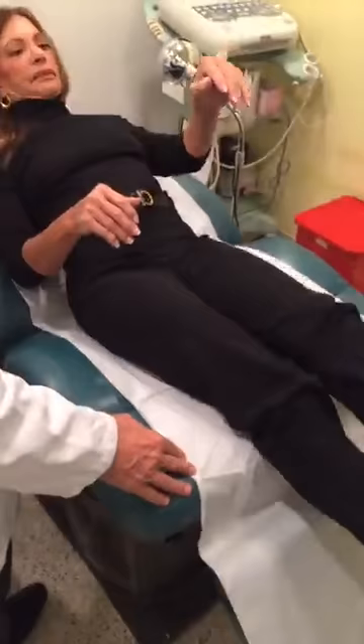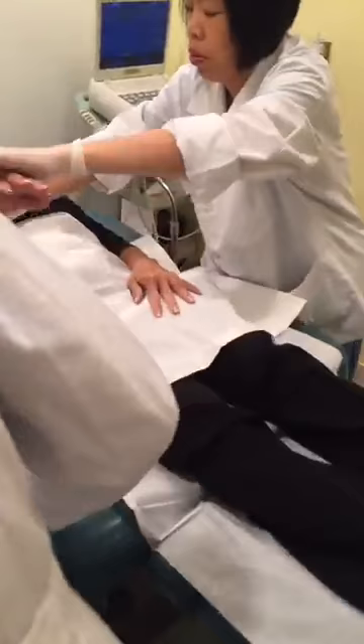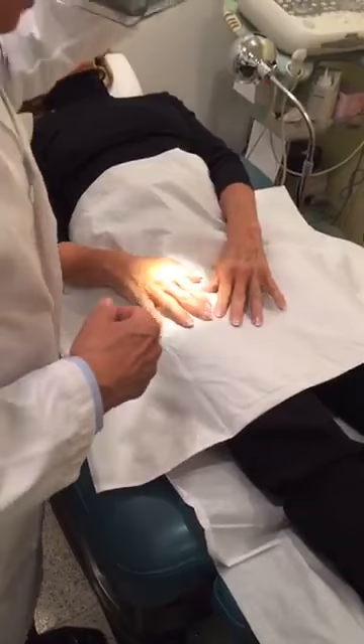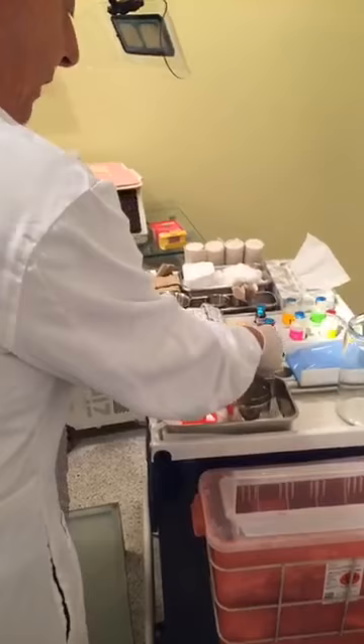First we will lay the patient down. The procedure is very simple — we just inject these veins with a solution that will slowly irritate the vein and make the vein disappear. The solution will irritate the vein, dry the vein, and the vein will be reabsorbed and will disappear.